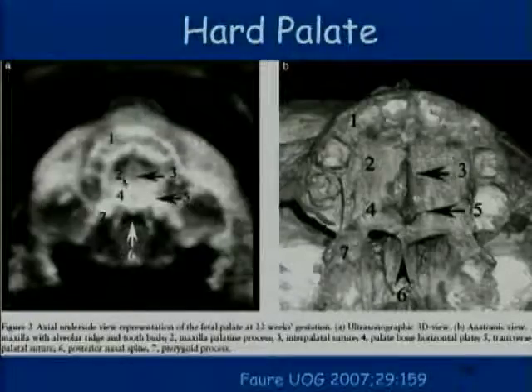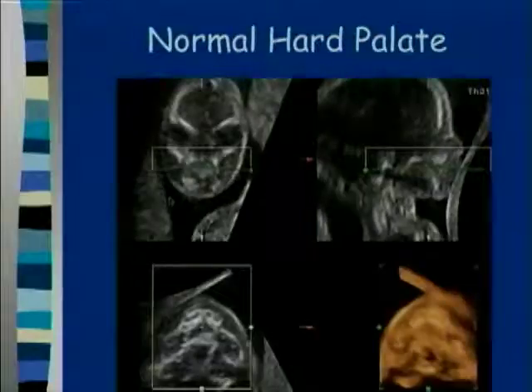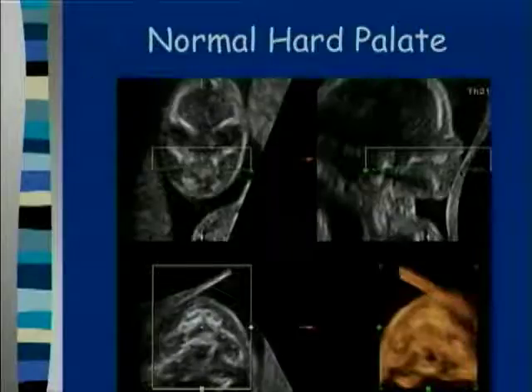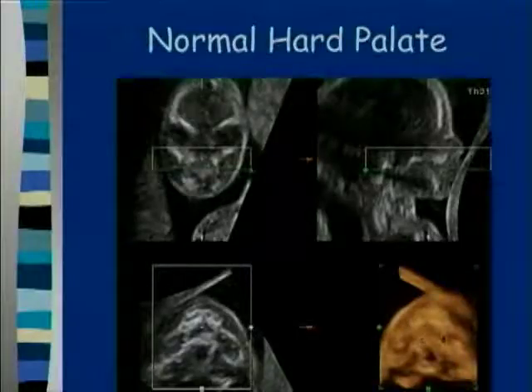I'm just still amazed at the types of pictures that he was able to get. With a little more experience, we changed in our lab to be more intuitive by putting the face upright and then having our rendering line slightly curved because of the curved nature of the palate, and looking at it upright because it was much more intuitive to us. And here's a typical picture with the palate right there, the alveolar ridge, the primary palate, and then the hard palate, the secondary palate back here.